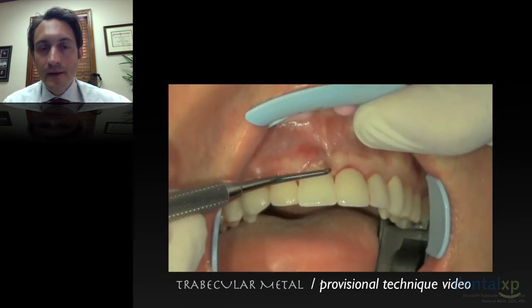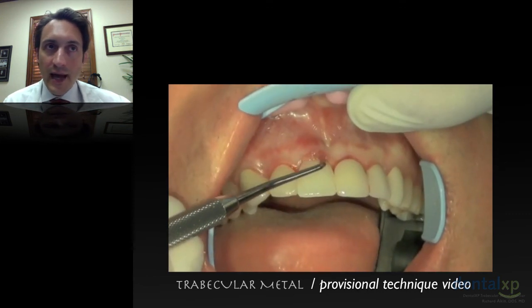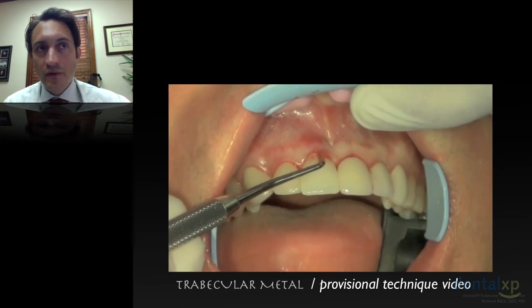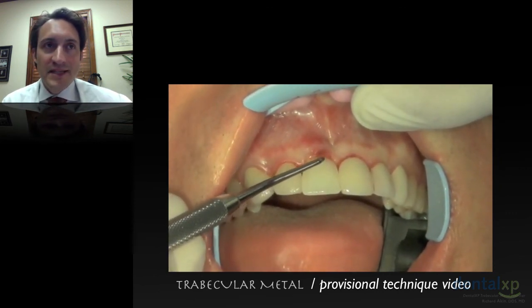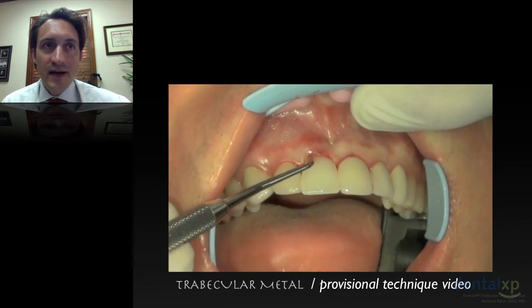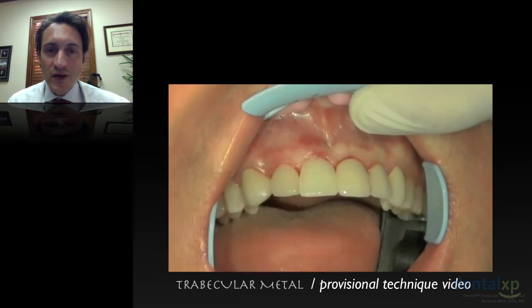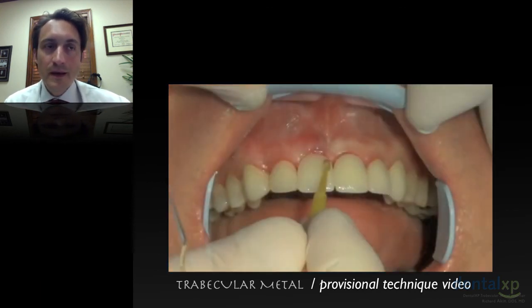This again delivers more growth factors and acts as a graft sealer and helps secure the graft into position. I don't like any dead space, and I think that's one of the reasons why patients have such good results with this as well. There's no dead space for swelling or inflammatory mediators.